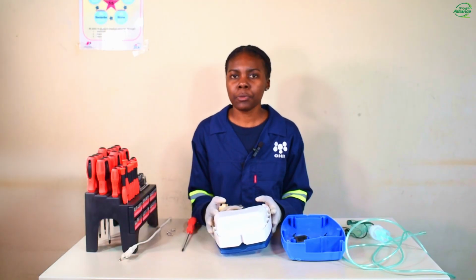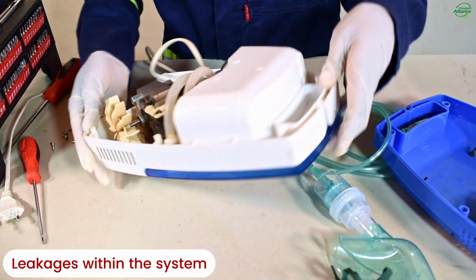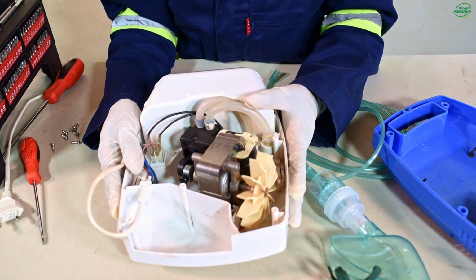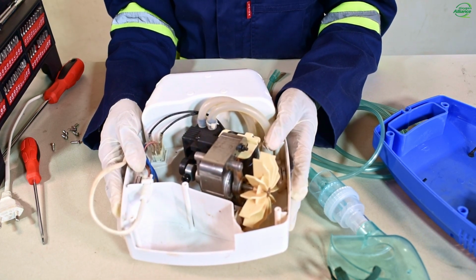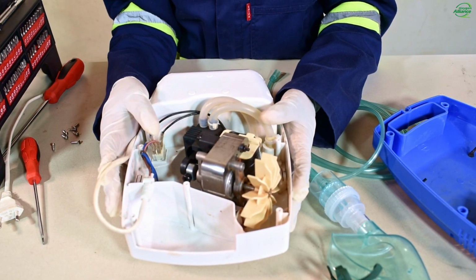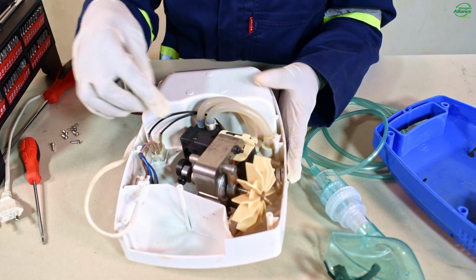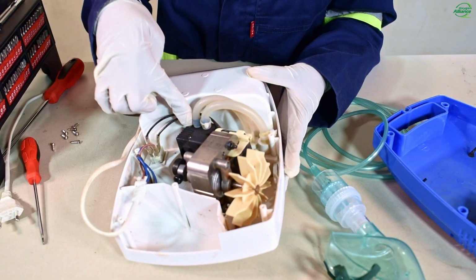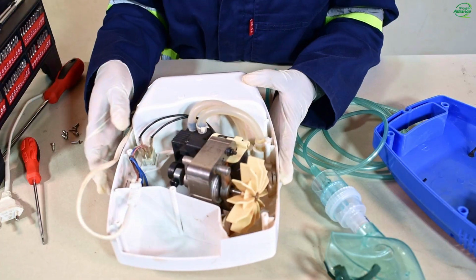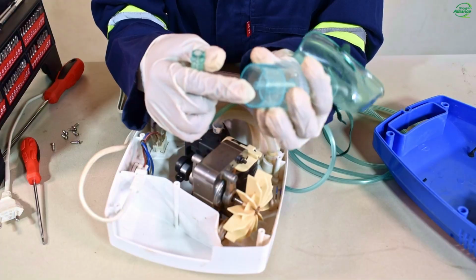Another cause of no mist production is leakages within the system. Leaks in the system reduce air pressure before it reaches the medication, resulting in reduced or no mist. Common causes of leakages include loose connections, and this is mostly on the compressor inlet tubing connection points, the compressor outlet tubing connection points, as well as the nebulizer kit's air inlets.